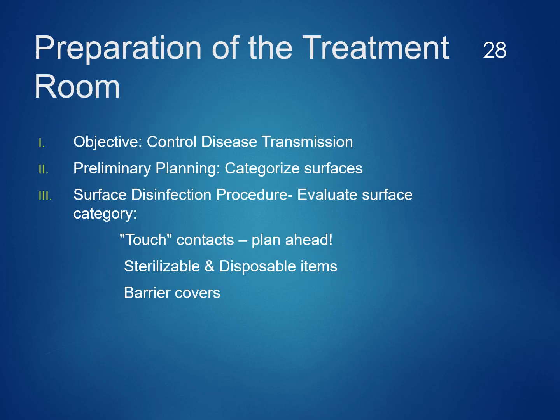In the preparation of our treatment room, I know we've been talking about that, the main objective is to control disease transmission. Our patients don't really know infection control procedures, and they ask you, what do you do to clean these areas in between patients, how do you sterilize your instruments, what is done. So all of these aspects are very important because patients are very concerned about that.